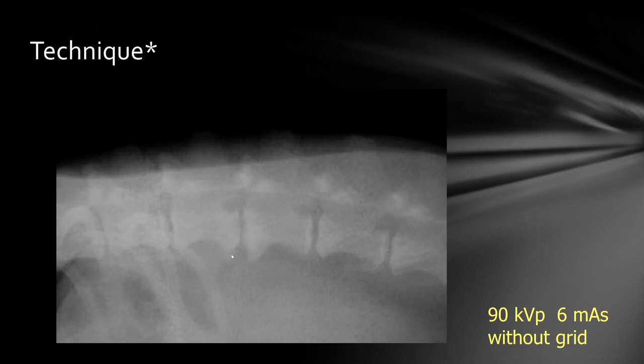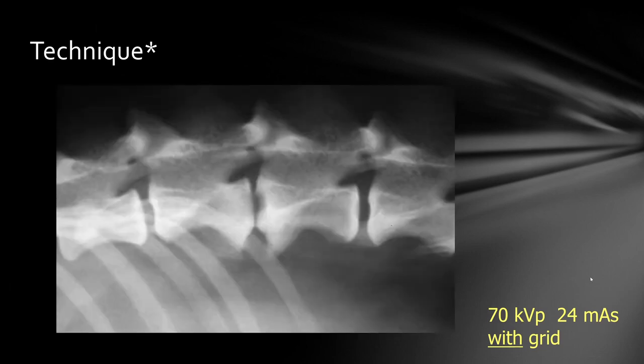You see that there is spondylosis deformans, but otherwise this is really unacceptable quality versus a bone technique where we lowered the kVp, went up with the mAs and used a grid, and you see that this gives you much, much better bony detail. In addition to the spondylosis deformans, you see this curvilinear end plate defect here that's consistent with a Schmorl's node, that's a disc that's protruding into the vertebral end plates. Much, much better bone evaluation with a technique like this.